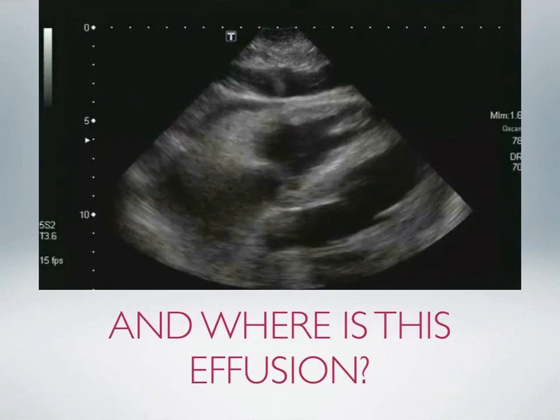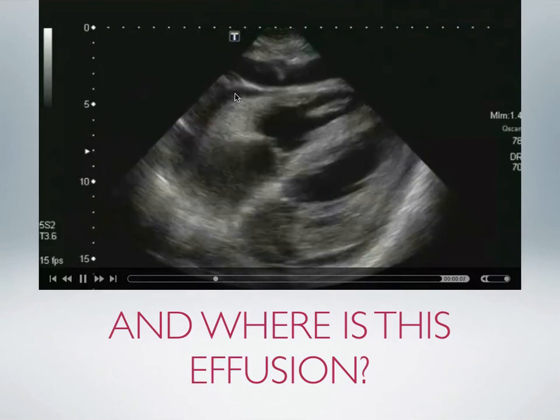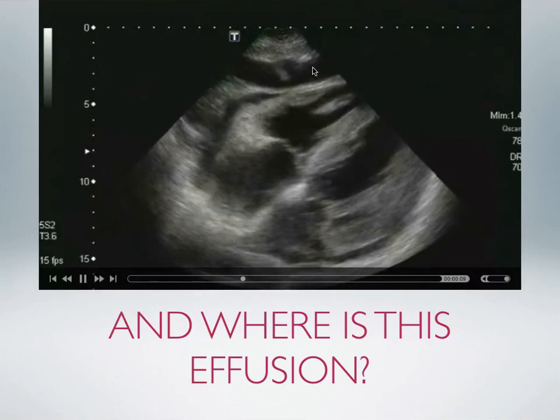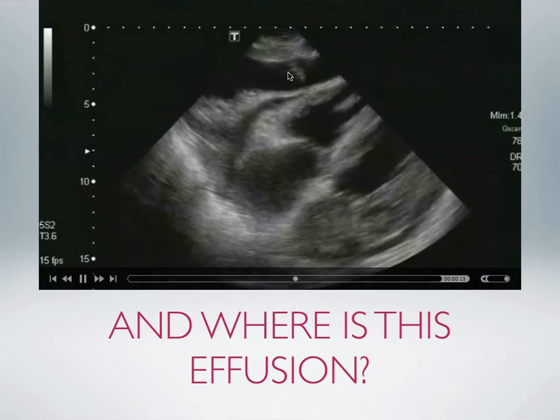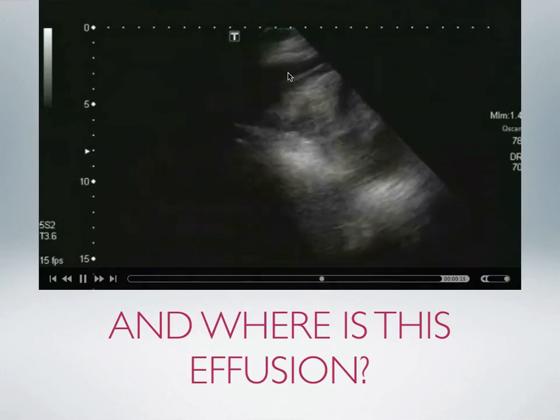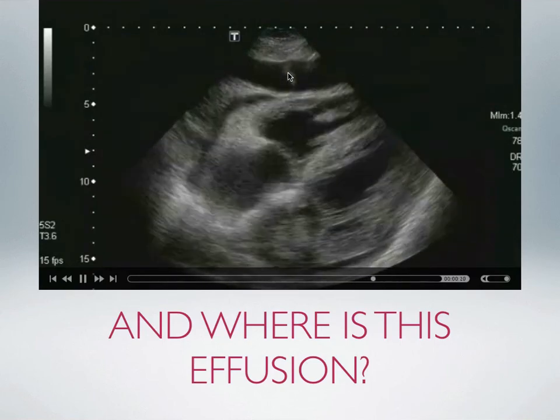This is another image with the same question. Where's the effusion? Small effusion up here. Liver. Ascites with a piece of omentum hanging down here. So two effusions. The ascites and the pericardial effusion in a subxiphoid view.